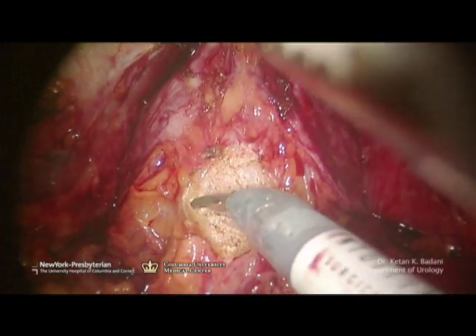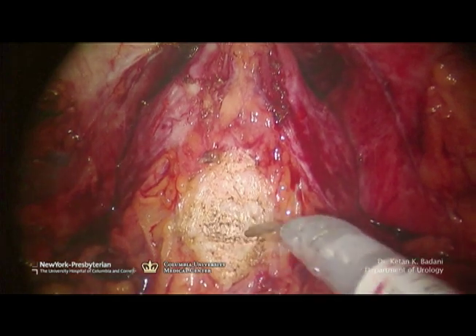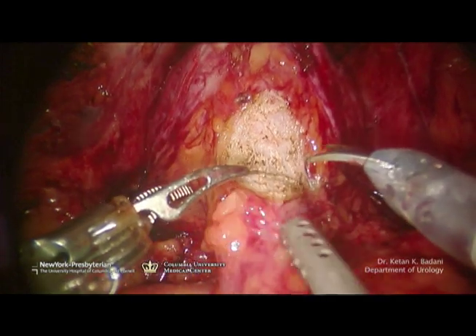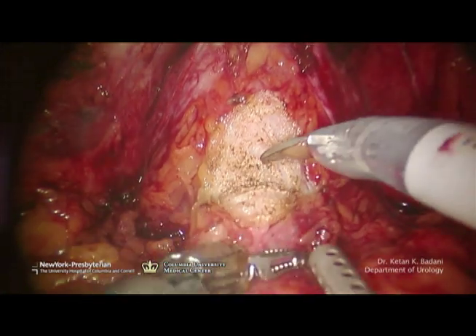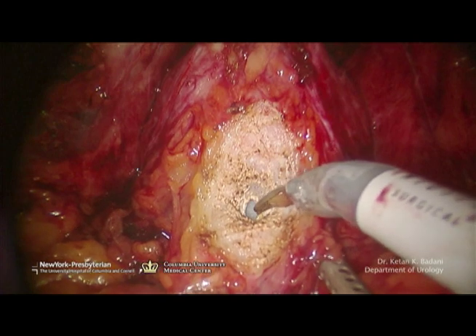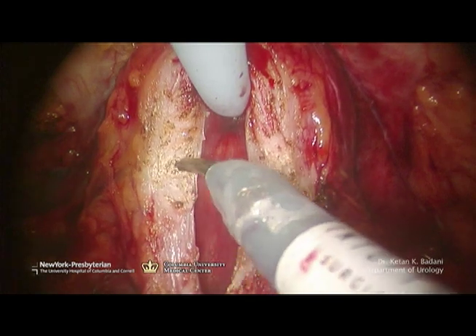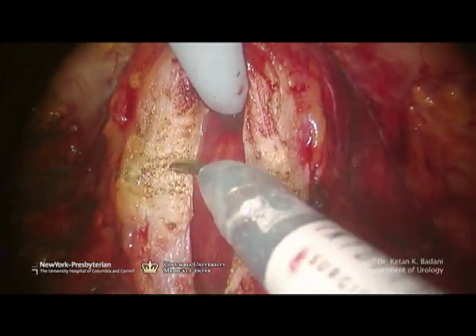I take this plane straight down, aiming towards the prostate, until I get down to the urethra. I'm staying in the same plane, and I'm in the soft white tissue of the detrusor muscle, so I know I haven't gone too distal. I'm giving a little extra traction with my fourth arm — you can see the stretching of the tissue — and that counter-traction is crucial to this step as it allows visualization. Here the Foley is encountered. I've stayed in the detrusor, and here I'm excising the superior edges of my dissection to minimize the size of the bladder neck.